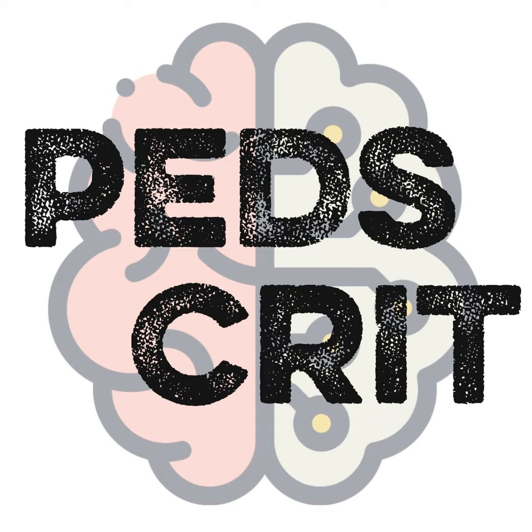Depend on that, right? But I think the main things that you're going to be reporting initially are your flow, your sweep, your RPMs in a centrifugal pump. And then you're going to start talking about your blood gases, like you just mentioned. The blood gas that you'll probably report out first is basically what you're achieving, and what you're achieving is what you're getting from the patient. So you want to report the patient's blood gas. The patient has an arterial line, ideally, in a VA ECMO patient specifically, in the right radial artery, and you're going to report out that gas.